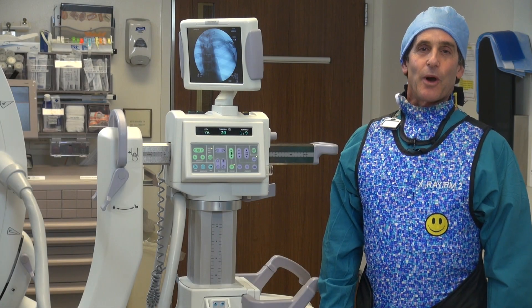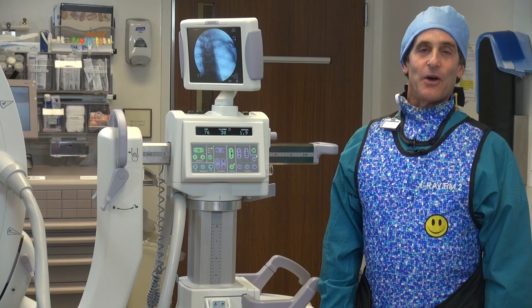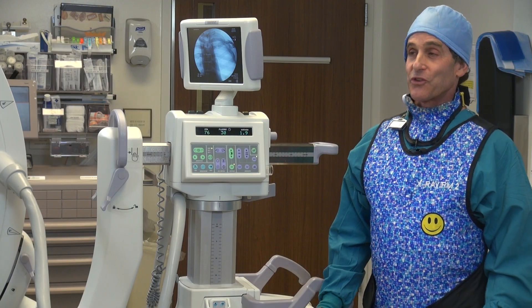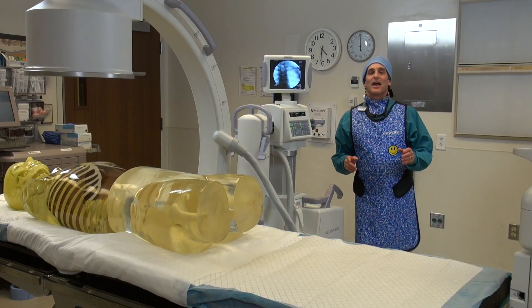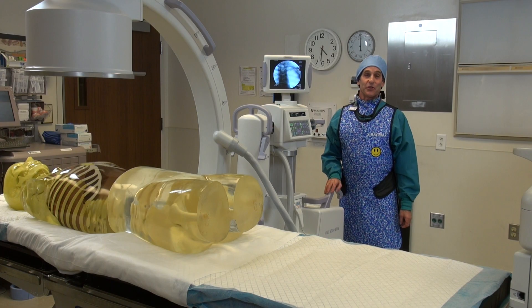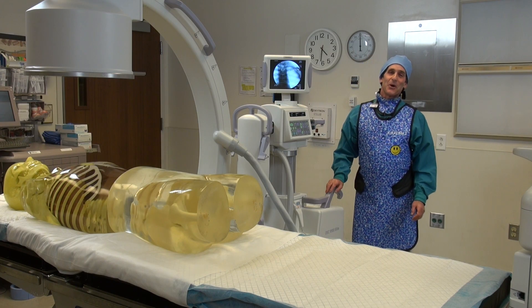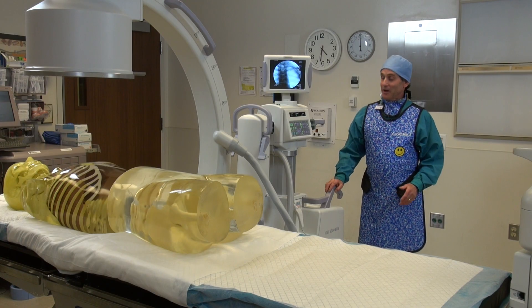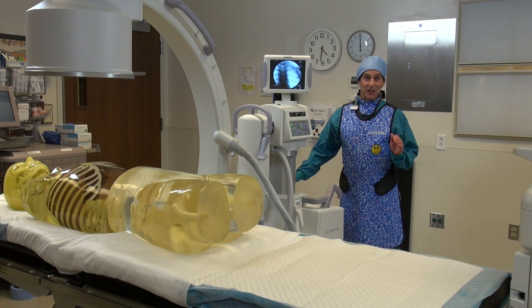Now we want to show you how to properly move the C-arm in and out and end up in the same place. The classic part of this whole story is that I just learned this trick last year and I've been a radiographer for well over 35 years. So I don't know how long people in my department already knew about this, but when I found out about it, it was like a life changer.